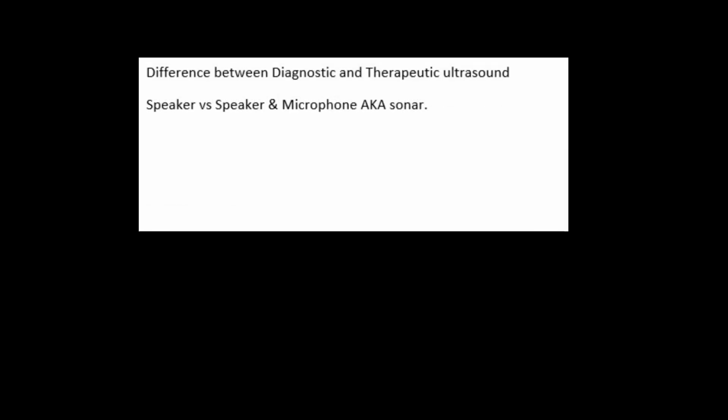So let's dive in. First one is your therapeutic ultrasound. Its only purpose is to emit sound waves into the body. That's it, and that's all it does. It is a speaker. That is it.